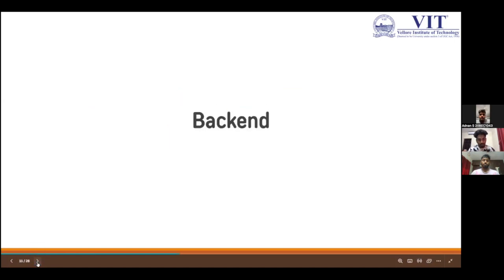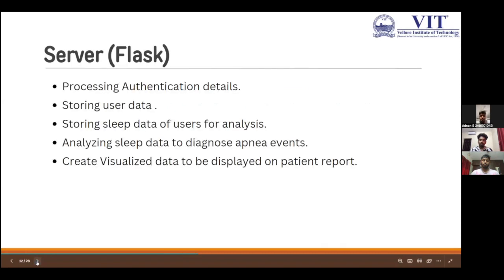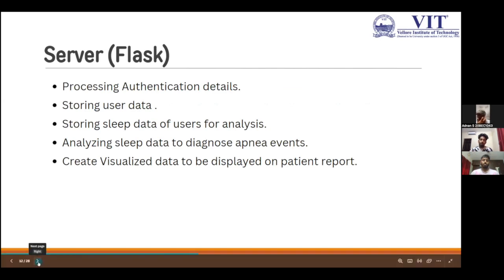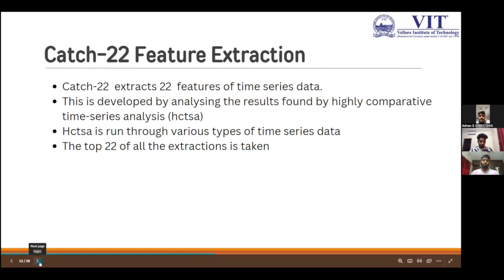Coming to the next slide, the backend part: the server is built with Flask. The authentication and, as I mentioned, the API endpoints are defined in the Flask application, and all of the user data will be stored in MongoDB. The server will also process the entire backend model of apnea detection. Amal will take over for Catch22 feature extraction.